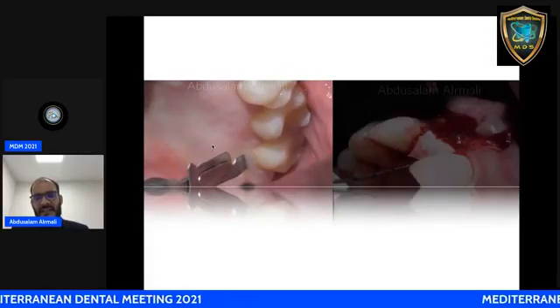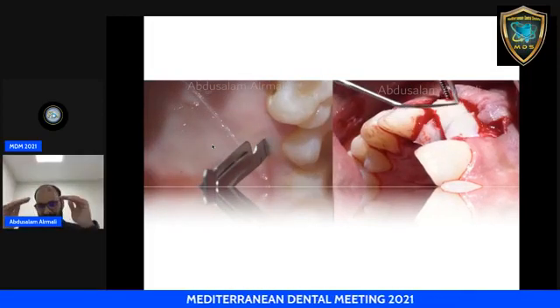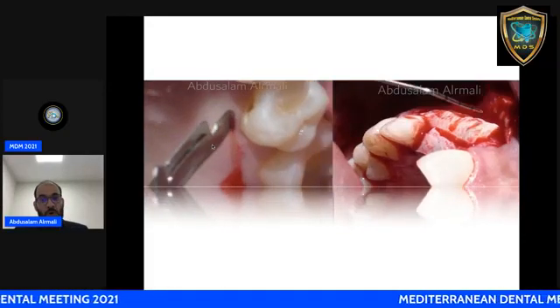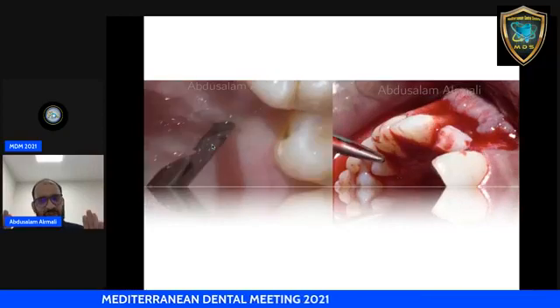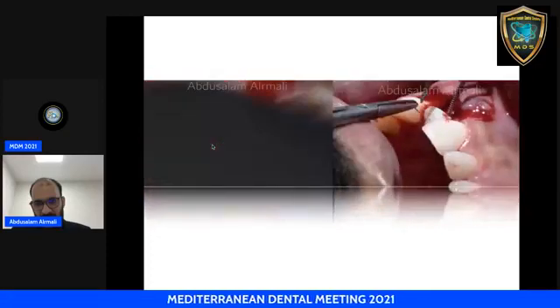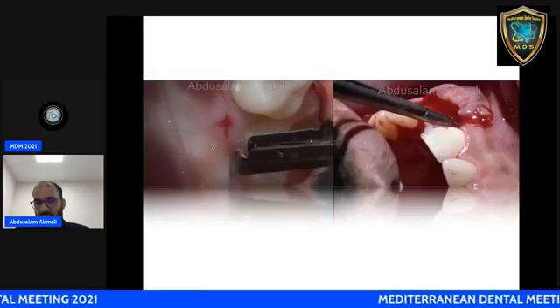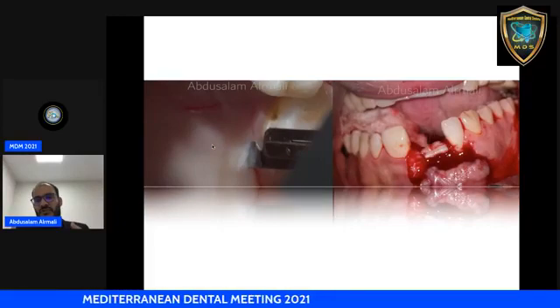After that, harvesting of the graft and suturing of the graft in a coronal, vertical and buccal position. Why vertical? To give support for the interproximal soft tissue. We have interproximal bone loss. It is not indicated to place bone because there is no place to add bone particles. But there is a place to improve the soft tissue height by placing the connective tissue graft platform first, sutured with 7-0 vicryl suture, and suturing another graft on the buccal side.